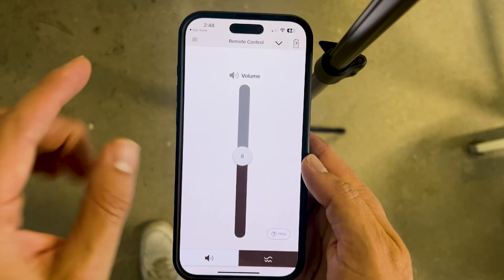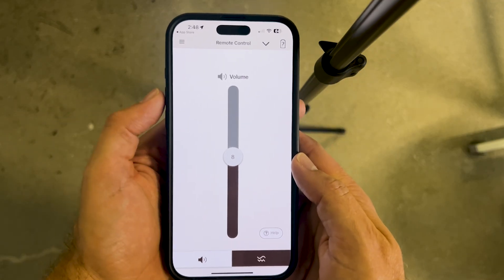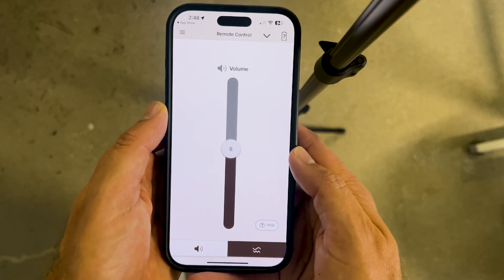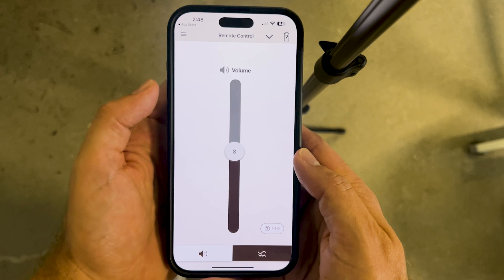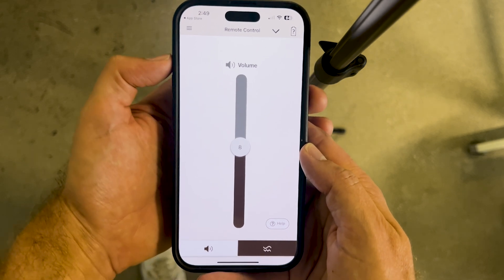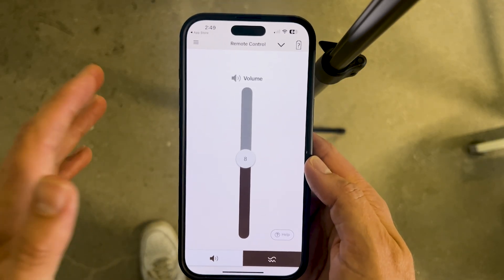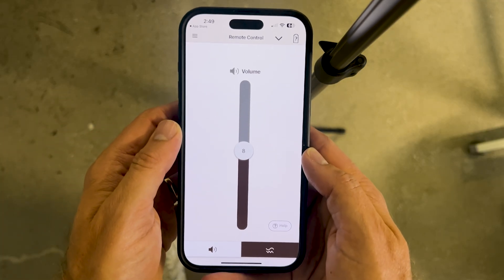It's important to note that both in the setup process and throughout use of the app, you'll be using the high-frequency sound that comes from your smartphone to actually control your hearing aids. This means Bluetooth is not what's making the changes — rather this high-frequency sound. You need to keep your volume at at least 75% and make sure your ringer is not on silent but on ring. This is one of the first things we offer folks if they're having trouble getting a connection between their hearing aids and the app.